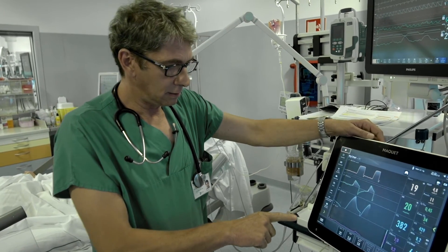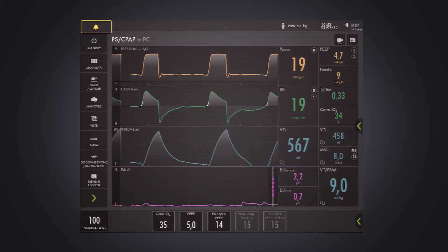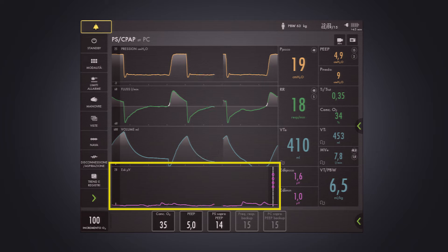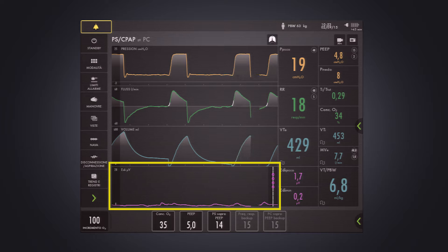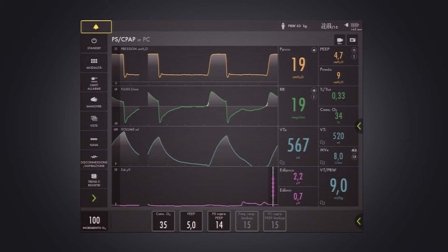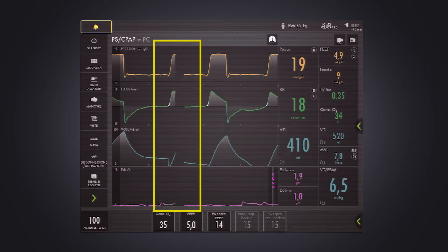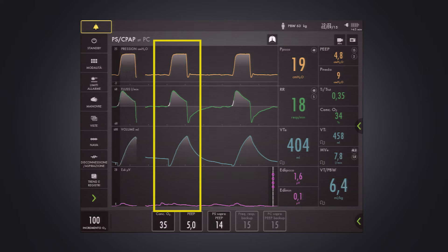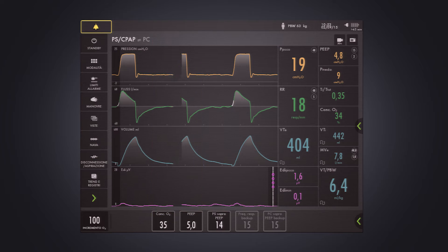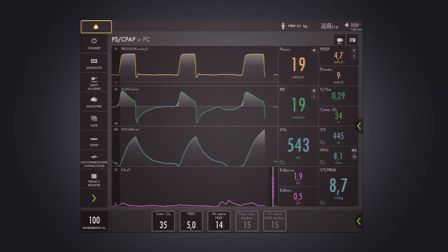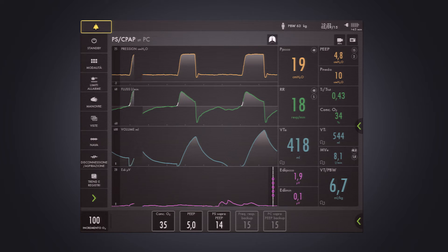As you can see, we don't have any EDI activity displayed on the ventilator, but we do have some degree of flow asynchrony. This flow asynchrony means lack of proportionality between patient needs and ventilator assistance — almost nothing is being performed by the diaphragm, but you have a planned activity of the ventilator.